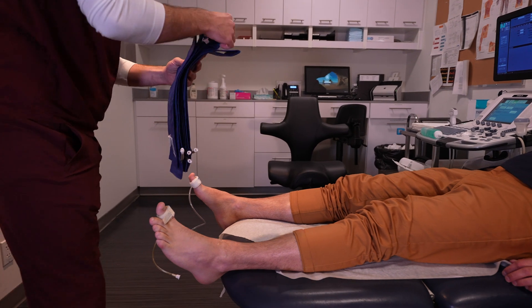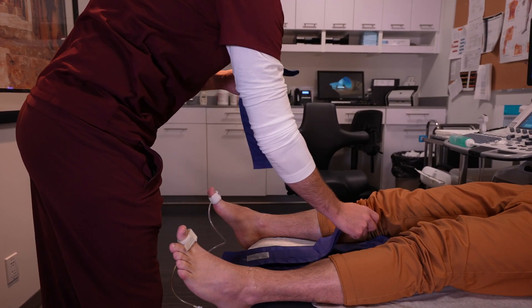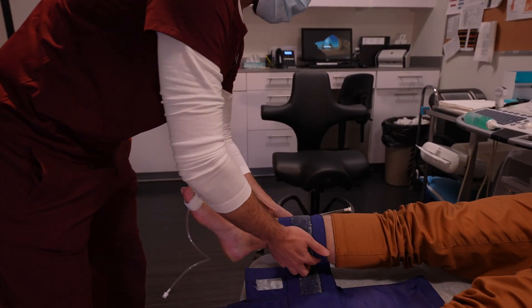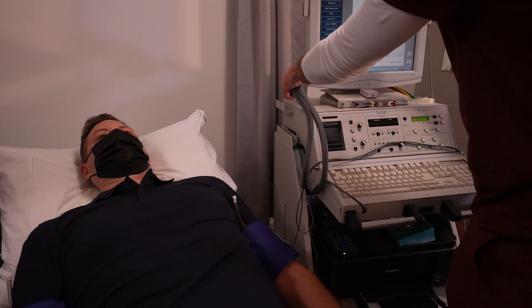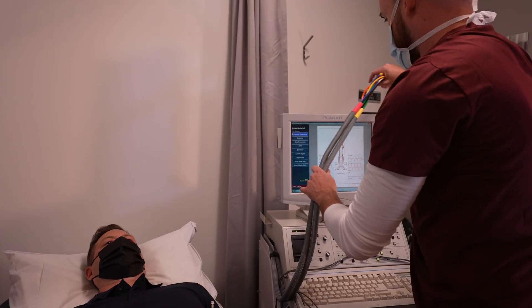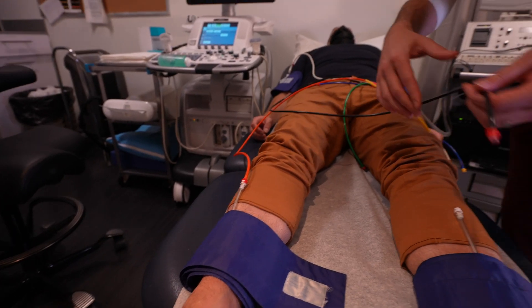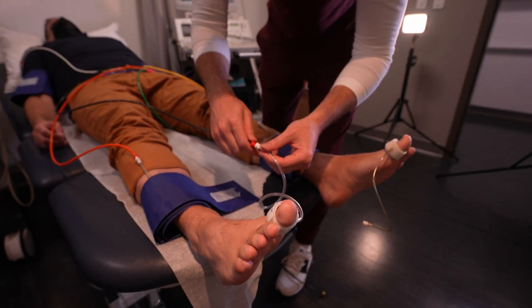For an ABI-TBI — which is an ankle brachial index or toe brachial index — we take an indirect measurement of the blood flow. This involves putting blood pressure cuffs on the arms, the legs, and the big toes, and we measure the blood pressure and compare them to each other.